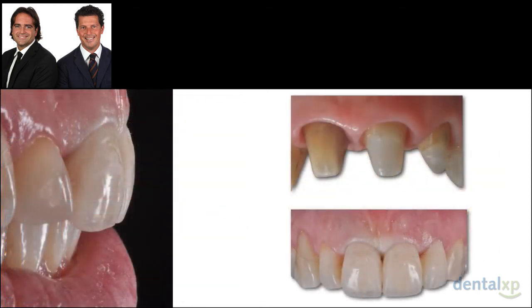Dottoressa Rita Agnoli, that is one of our co-workers, does the retreatment, and then we can rebuild with an aesthetic material, with a white material, because we chose to use a metal-free restoration, and of course we have to rebuild the teeth with white material.